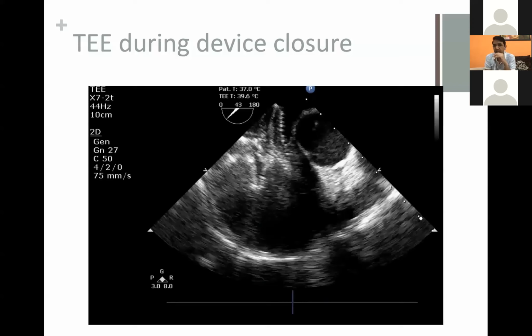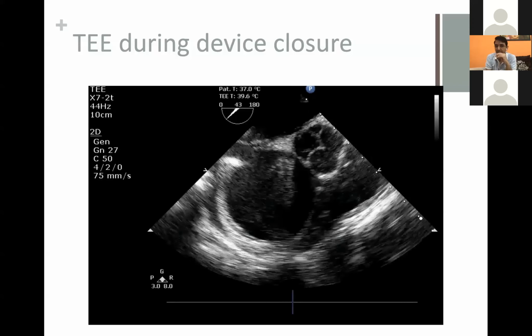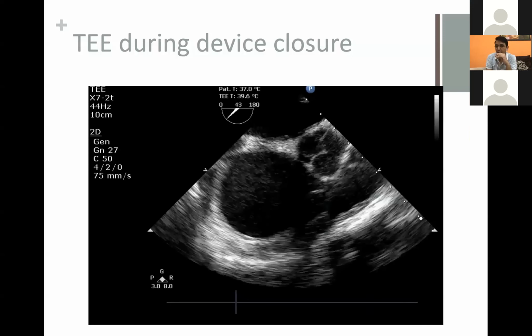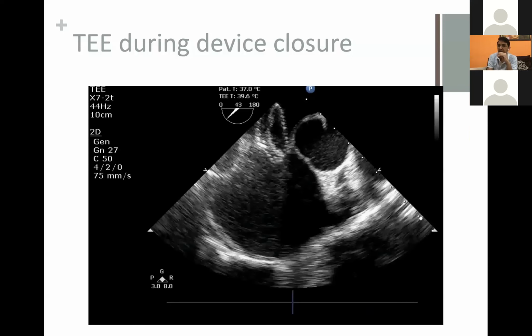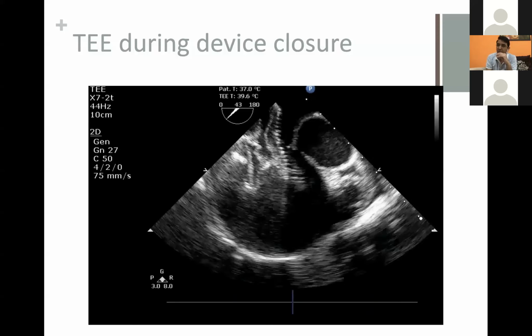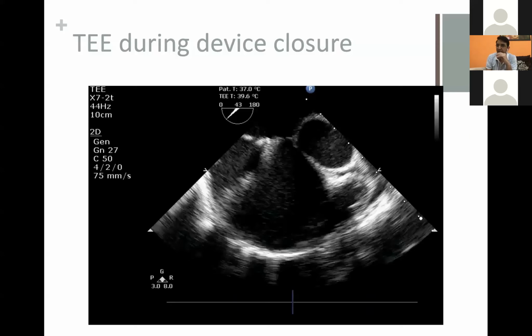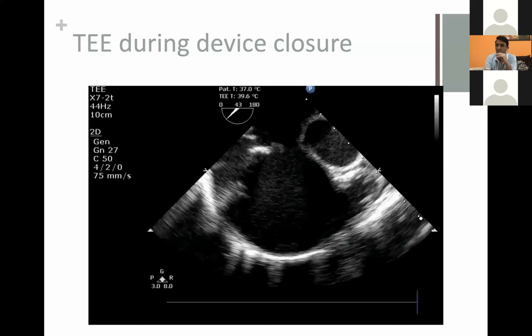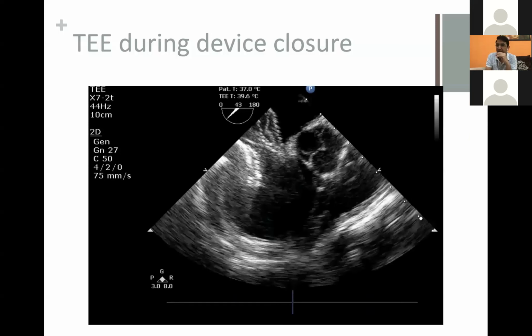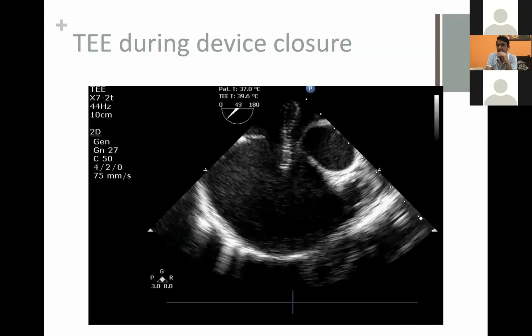Thin rims are not well seen on CT. Rather, there can be artifactual dropouts in the septum in the area of the fossa ovalis, even if it is actually intact in the patient. It is also related to the way we acquire CT scans, because we can't reduce the unopacified blood coming from the SVC and IVC, and the rapidity with which the CT is taken.